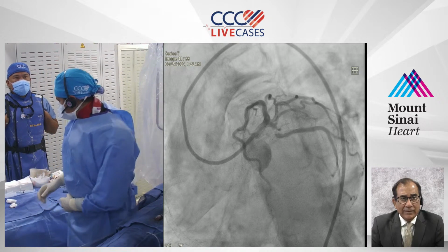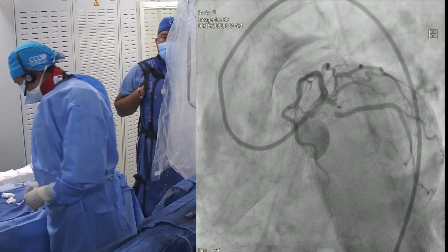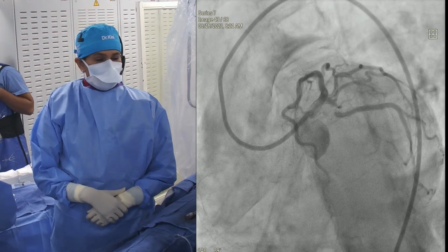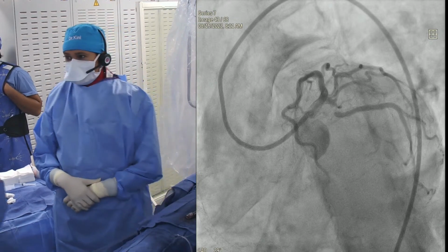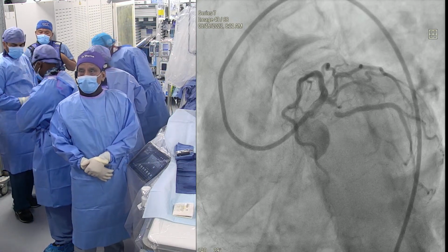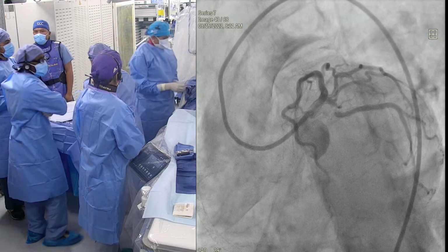And what will happen, and we predicted in that case also, is that even with your small rota burr, first let's see how the wiring and our exchange length catheter will be. Use a rota floppy wire and use a small burr, maybe 1.25. What it will do is create a gutter. It will make a parallel lumen, which is okay. But that means you have cut the internal elastic membrane so that now you can dilate with a balloon and subsequently stent. You see that there is a tremendous calcification at that level.